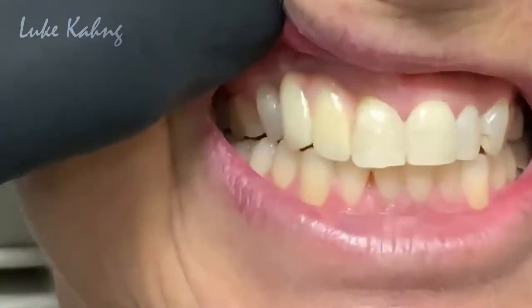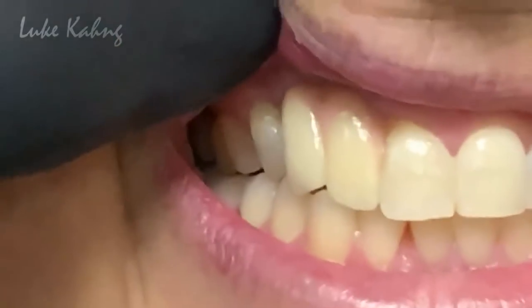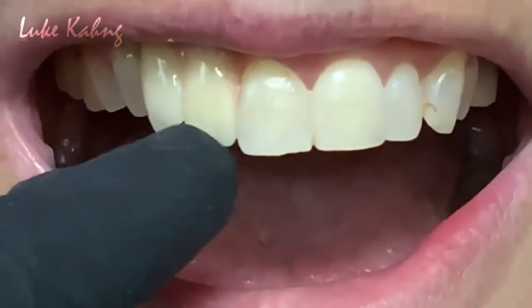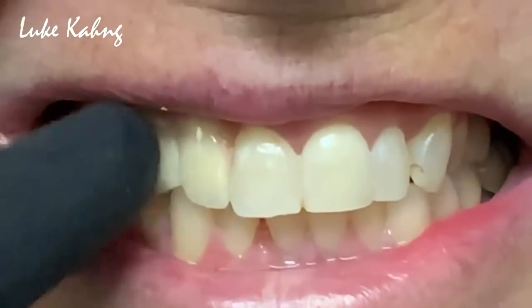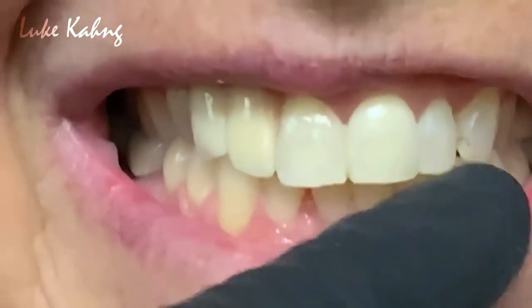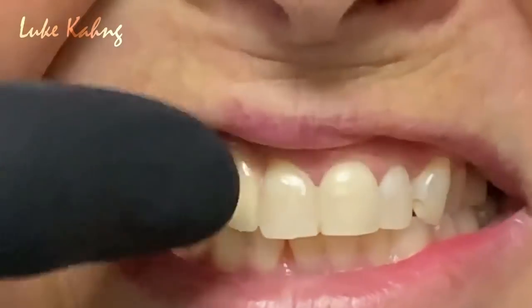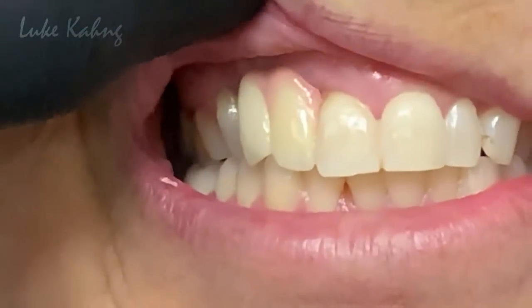Gotcha. So this is gum — the tissue is really high. We're going to make it match the adjacent teeth. I do notice this lateral is more yellow than the other side, so I'm going to tone that down. This one — the canine — is good. And then this one I have to tone down just like the other side teeth. And I'm going to match the CEJ as close as possible. I took the tissue color as well.